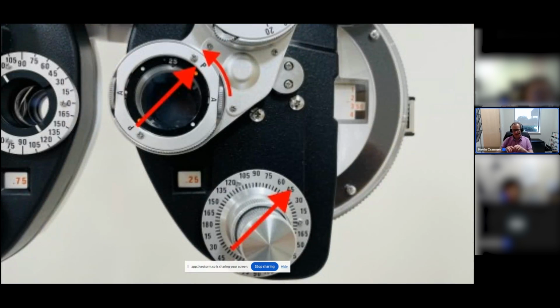You can see there's this knob on the bottom of the screen. There are little tick marks on the knob, and right now they're pointed to about 40 degrees. They're covered up by that red arrow, but that's the axis that you're set to. You can see that the P's are parallel to that axis, so now you're in the power measuring mode.